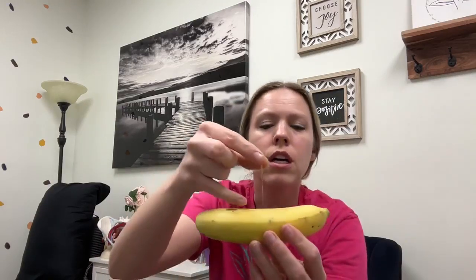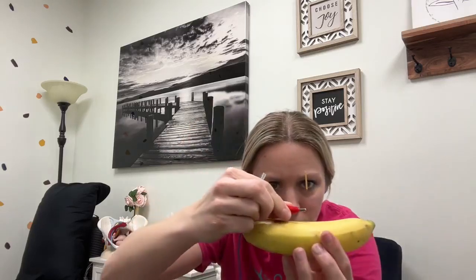It's hard to do one-handed. They look like little jumper cables. You can kind of see, and then we would clamp that onto the metal. And obviously, because metal conducts electricity, when we put another needle somewhere else, that electricity is going to go down to the needle, find its friend, and then come back up. And so this is much more effective than like a TENS unit, which is just electrodes on the surface, because we are getting all the way down to those much deeper structures.